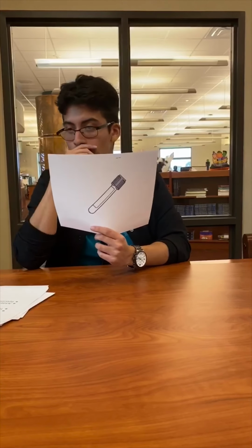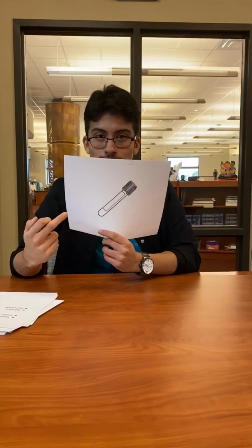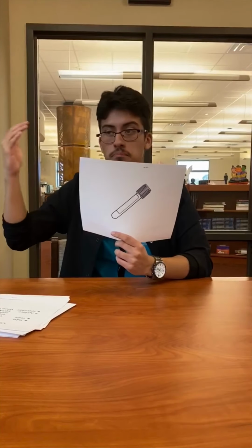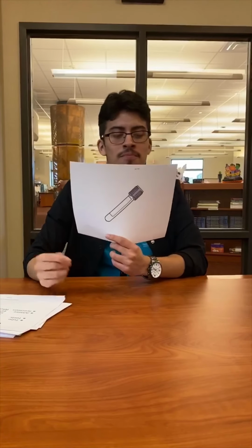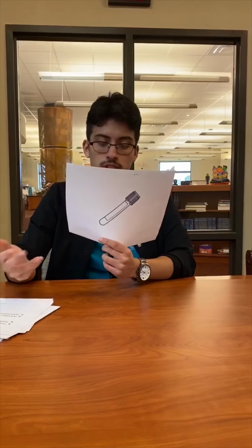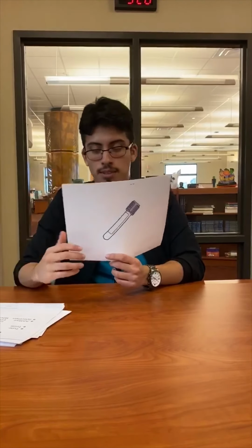So for example, if someone wants to measure your alcohol levels because you say you're not drinking, they would use this gray tube to see how far along the alcohol blood test is, possibly higher than the 0.08%, which is really bad if you're driving. The additive is an antiglycolytic agent that preserves glucose, perhaps with the anticoagulant potassium oxalate or heparin, but it's more on potassium oxalate. And its specimen is plasma.